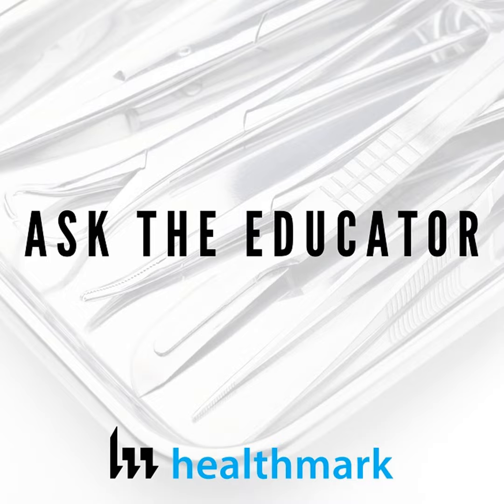And then if the transducer is directly touching sterile tissue, then the situation is critical, or the procedure is critical, and it requires sterilization. Because the transducer can transcend all three categories of Spaulding, it causes some confusion to the end user, because that same transducer in a single day can be used for a non-critical in the morning, a critical in the afternoon, a semi-critical right after, back to non-critical. And so the disinfection process that needs to be applied is different prior to each patient use. And because of that, it's caused a little confusion.